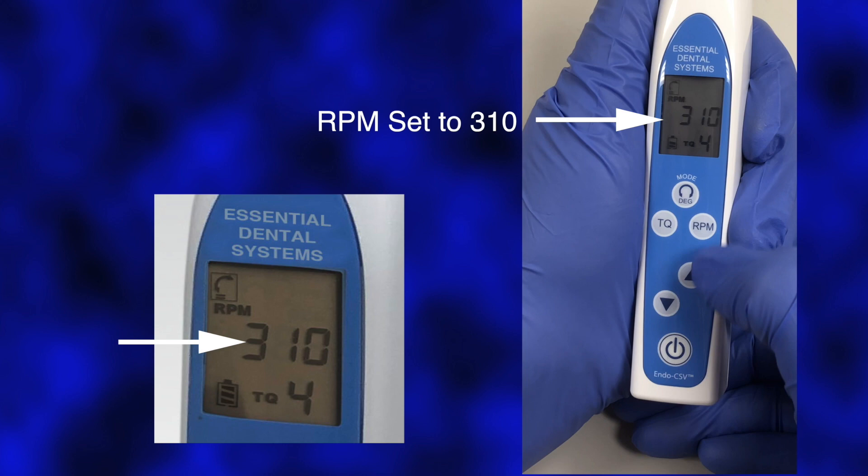Press the RPM setting button, then select between nine RPM level settings by pressing the up-down selection buttons until the desired level is selected. Select an RPM of 310 for use with the SafeSiders HF instruments.